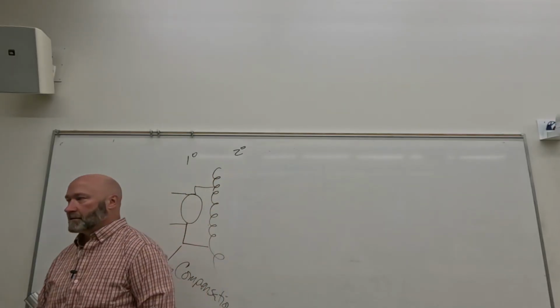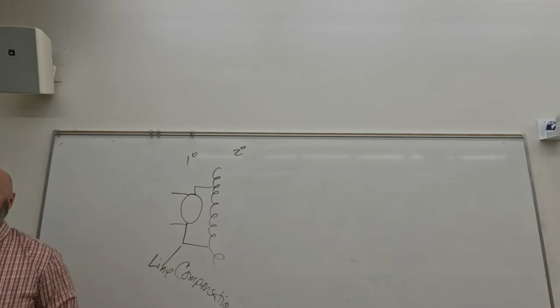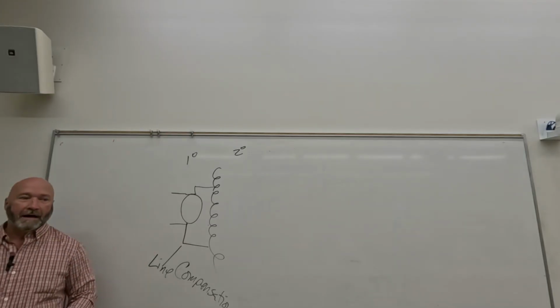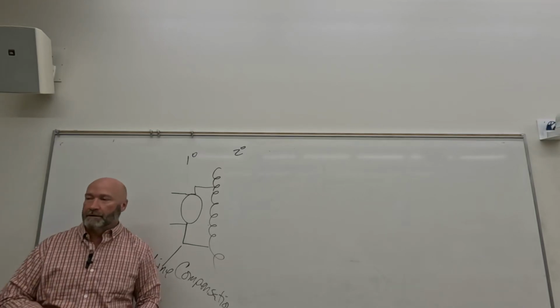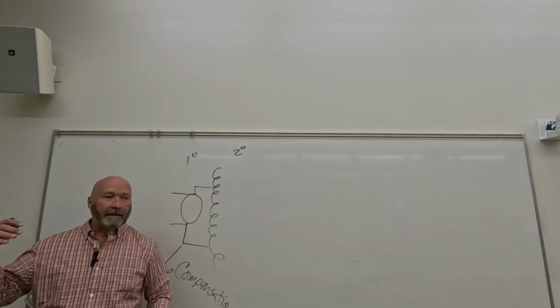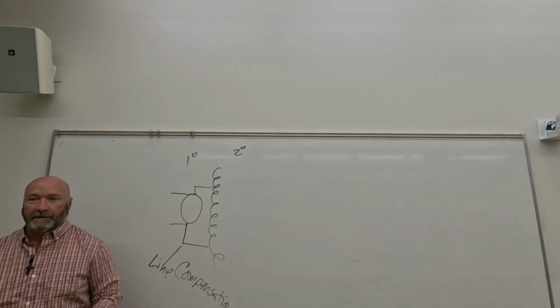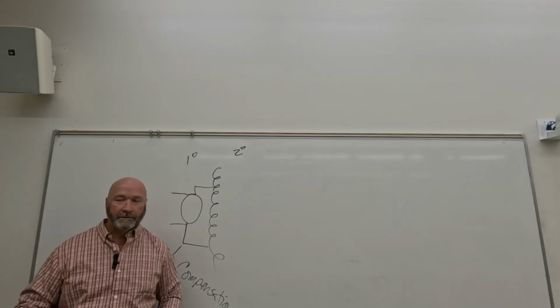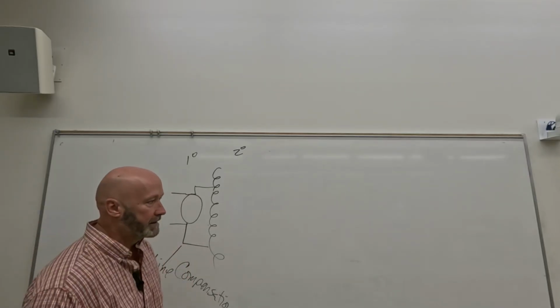Your mA stations are going to vary wildly depending on your machine and the manufacturer. Some might not go below 200, some might go all the way down to 25 mA. And some may go up to 600, some may go to 1200. So it's going to vary wildly. So it could be 100 all the way up to 1200, and that's what you're going to be testing on.